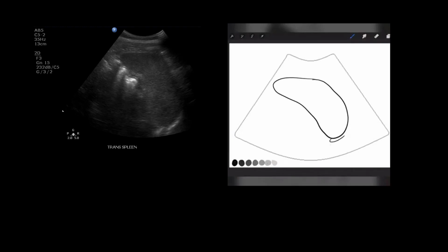The way that you will hold your transducer over the rib spaces does oftentimes cause some rib shadow. So we might see some rib shadow along the border. We might see it through the middle, just depending on where the anatomy of the spleen lies underneath the ribs. We can also see the diaphragm on the posterior portion as it wraps around. And again, we'll see bowel in this area. If the left kidney is present, we should be able to double check that to a transverse left kidney. It should match up with our transverse spleen image.